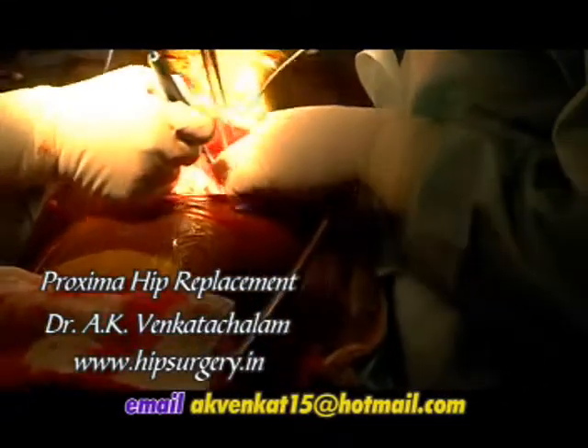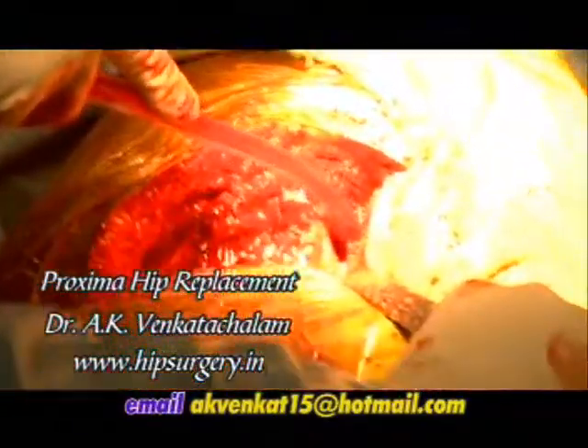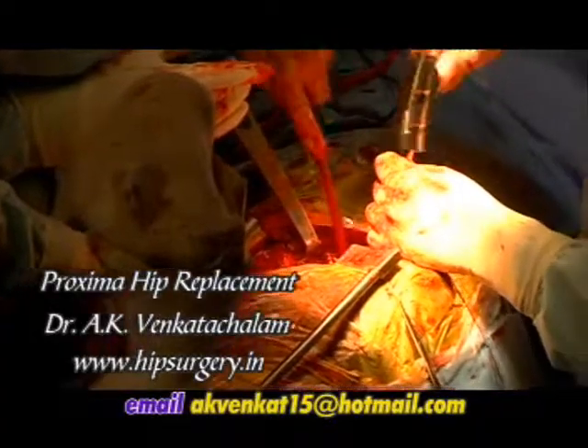After complete exposure, the hip is dislocated. The head is decapitated at the level of the junction between the head and neck. The dimension of the prosthesis exactly matches that of the head.